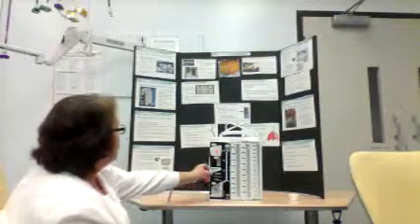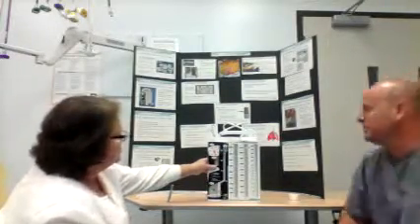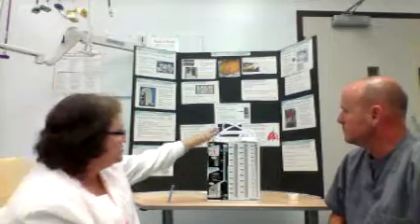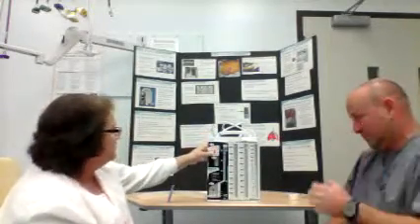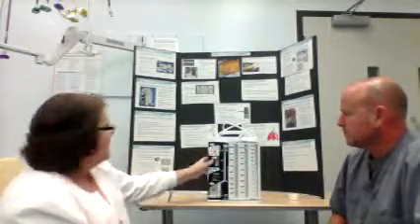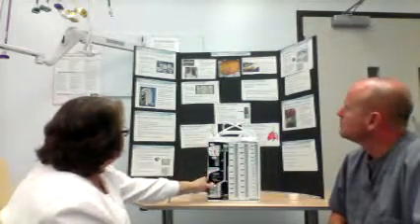One of the things you might want to do is check the drainage system to make sure that it's upright, that it hasn't fallen off the bed, or that if it was sitting on the floor, it didn't fall over. If the drainage system is attached to the bed and everything looks fine and none of the tubes have come disconnected, then you may want to elevate the patient. Elevating the patient into a semi-Fowler's position will also help enable drainage from the chest tube side.